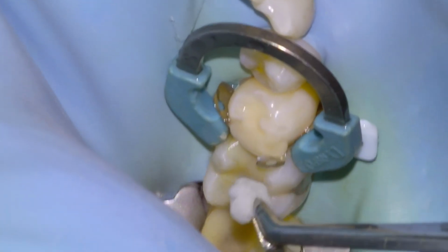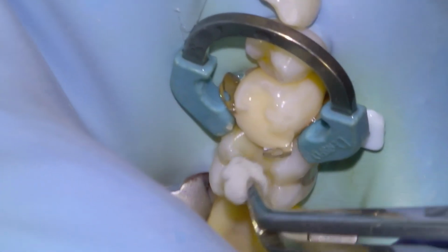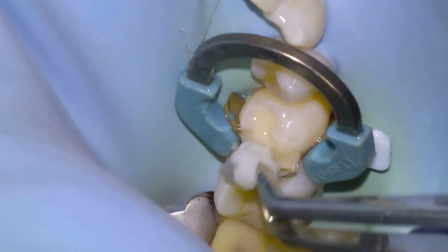And this is a time set material, so we're actually going to take a few minutes, do a recall, have a sip of coffee, and then return when it's set.